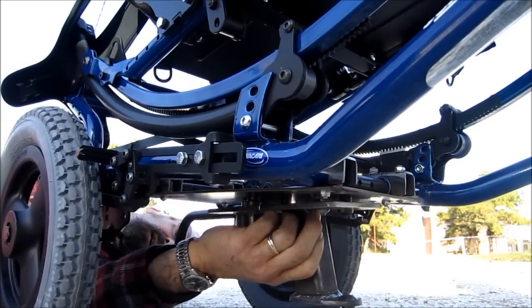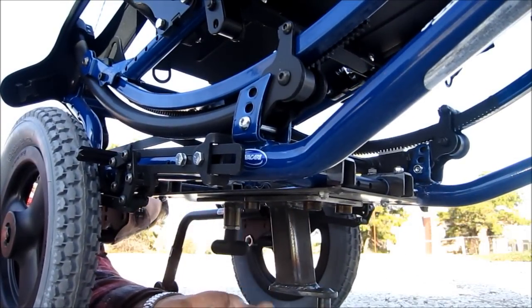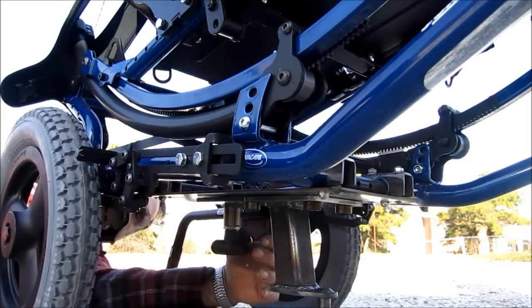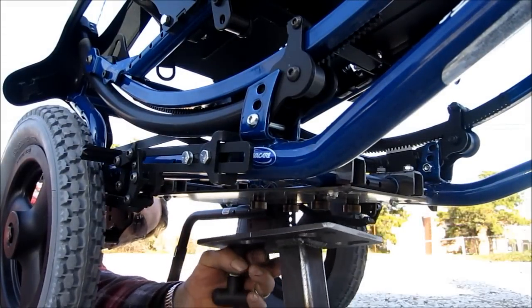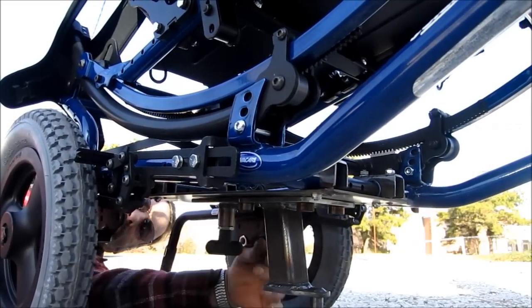You can reach in and snap that right in there just like that. Now this is the ground clearance problem when riding around, and that's why he requested a removable pin here. To remove it, you just pull this down, forward, and then you've got it off. That's the beauty — that's what I was trying to incorporate on this.